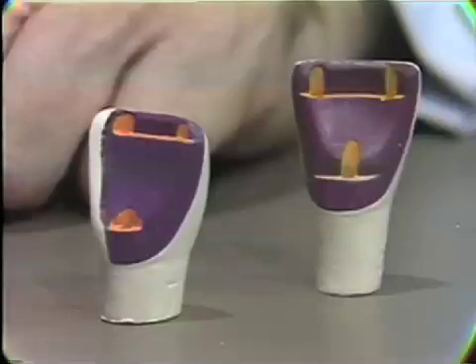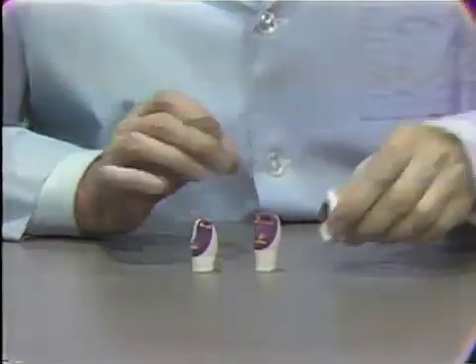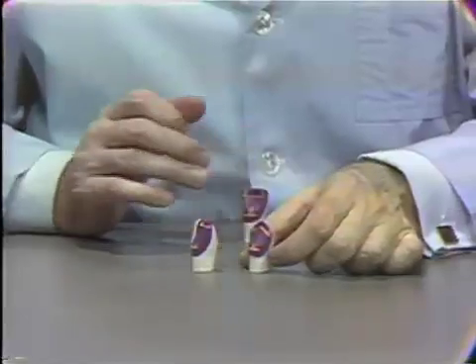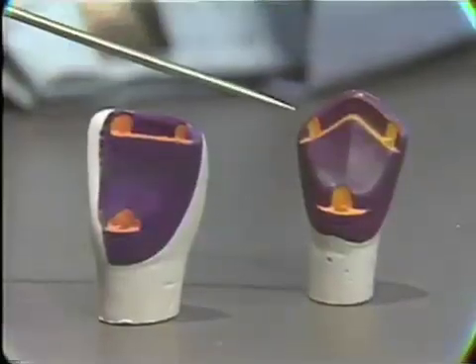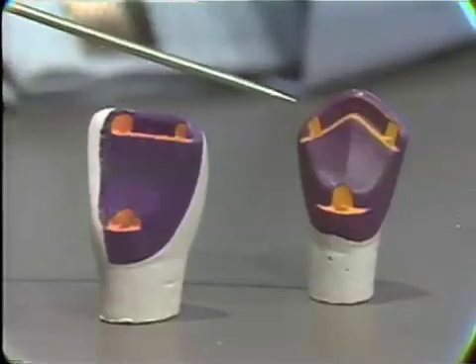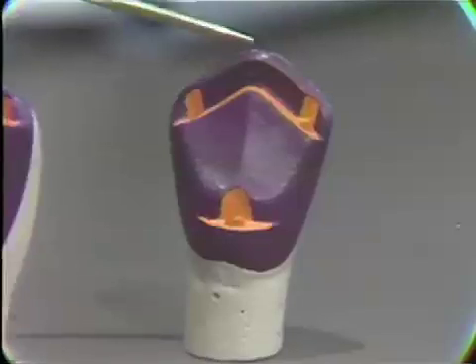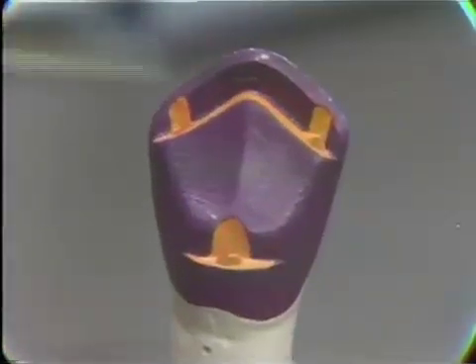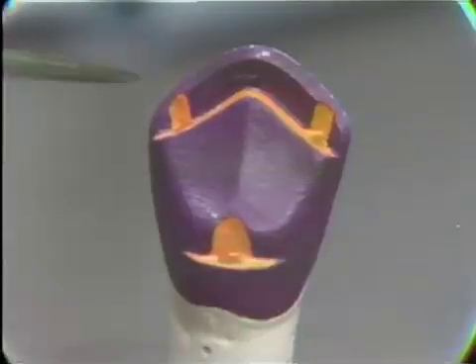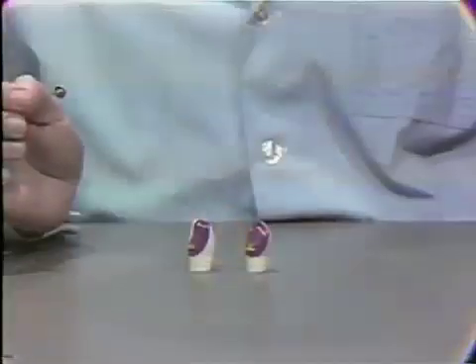This same basic preparation can be used on many teeth with a number of different variations. When it's done, for example, on a maxillary cuspid tooth or a mandibular cuspid tooth, then the incisal edge is modified a little to conserve the tooth substance, and instead of running straight across has this rooftop situation that you see in this particular model here. Again with 3 pins, one at either end of there and one on the cingulum ledge.